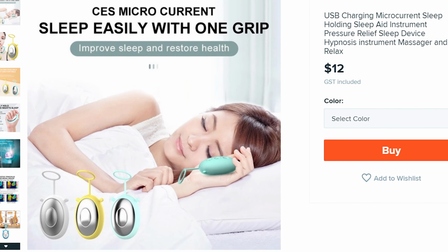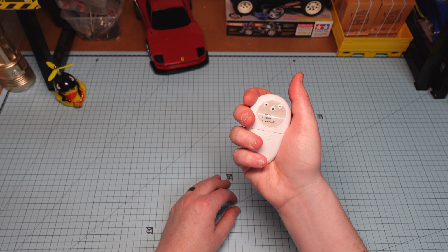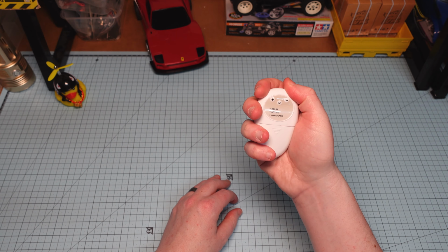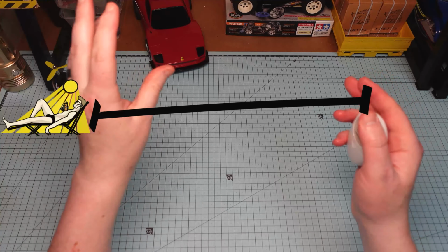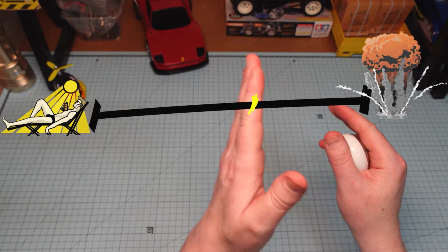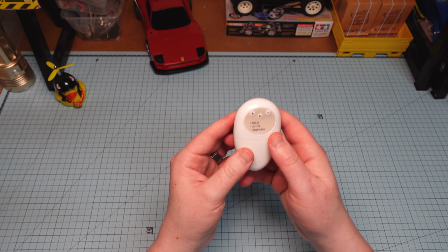Turn it on and hold this in your hand while you fall into a deep, relaxing sleep. I've tried it and yeah, didn't really make me feel relaxed. In fact, if you had a scale and on that scale you had relaxed and you had bombs going off, it would be somewhere up this side. And I'll demonstrate why. Let's turn it on.